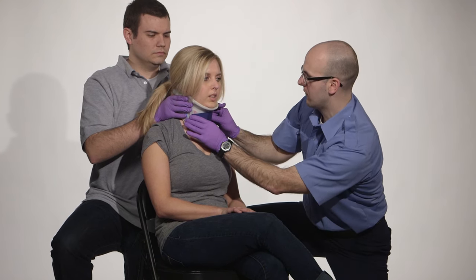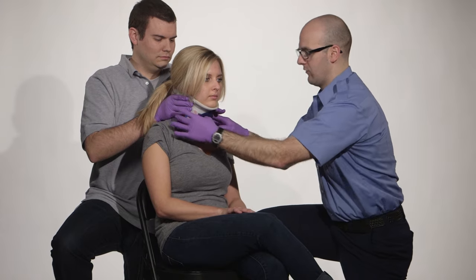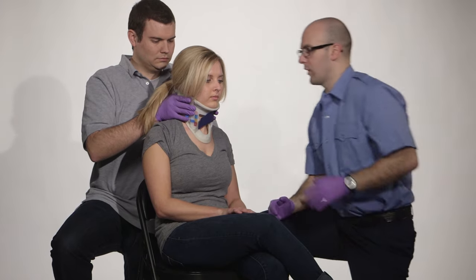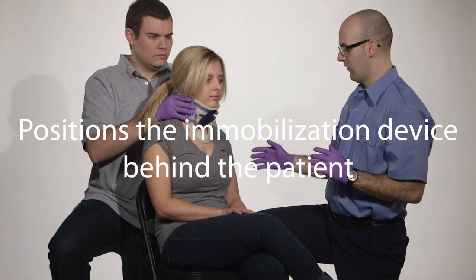Can you open your mouth for me a little bit? Perfect. Now that I have the C-collar on, we're going to position the KED device behind the patient.